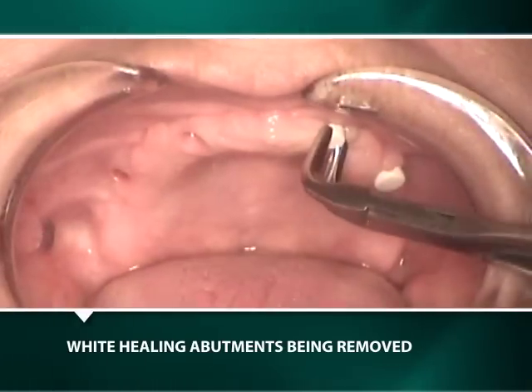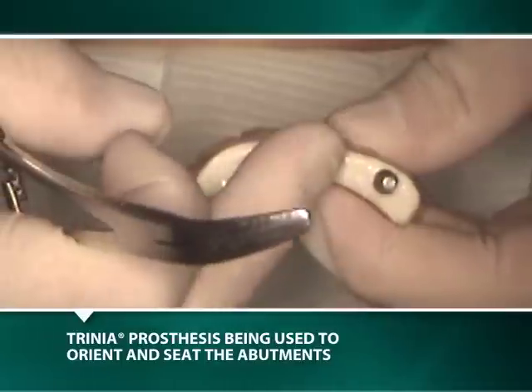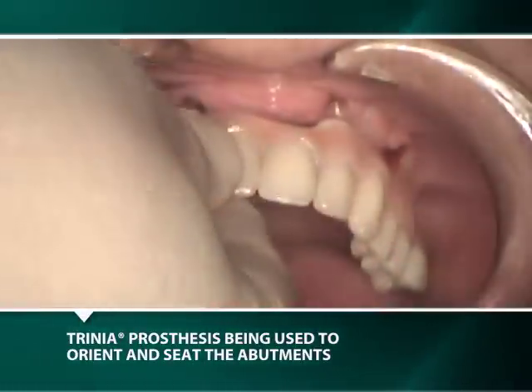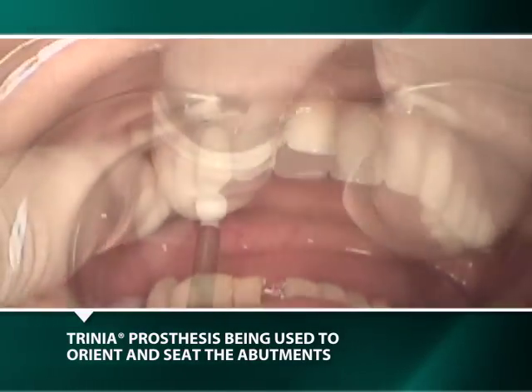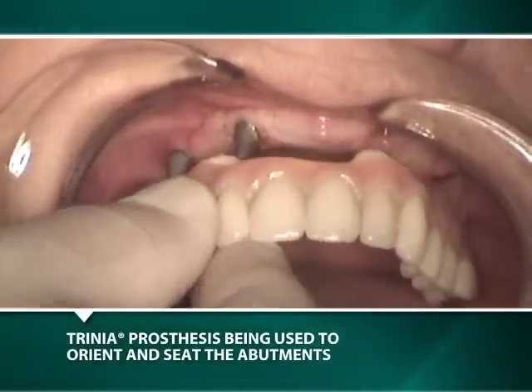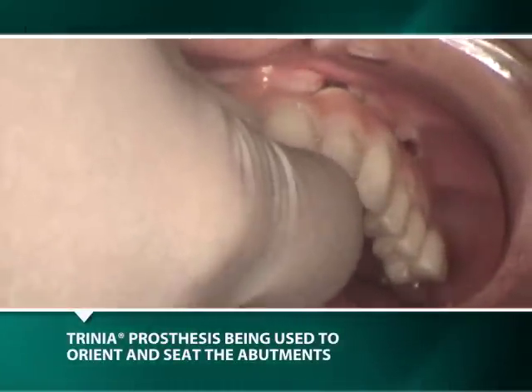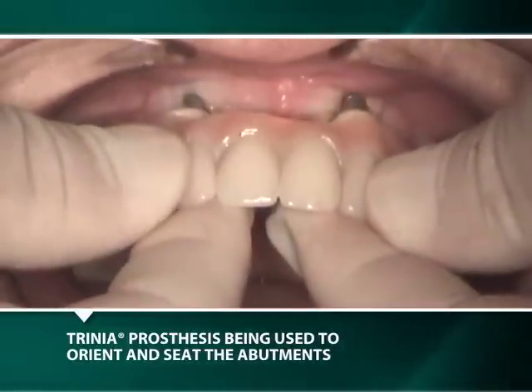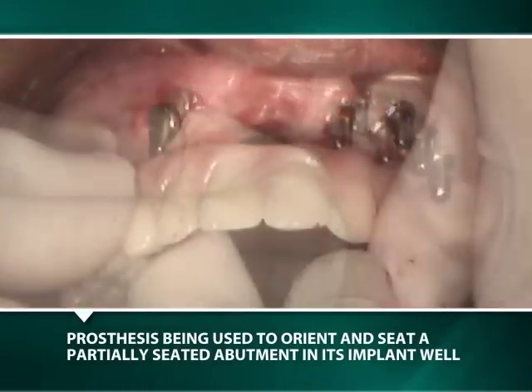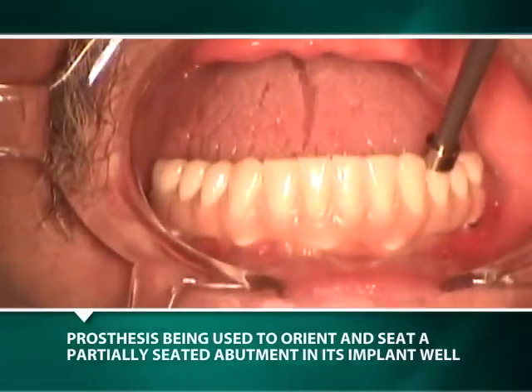After removal of the temporary abutments from the implant wells, at least initially, 2 milled abutments are incompletely inserted into the prosthesis and, if necessary, stabilized with an application of Vaseline prior to their being transported to the mouth and inserted into the well of their implant. Once the abutments are initially seated, the prosthesis is removed for the definitive seating by tapping directly onto the titanium abutment. This seating process is continued until all the abutments have been definitively seated. Alternatively, an abutment may be loosely seated initially in the well of the implant prior to the prosthesis being used to orient and seat the abutments in the well of the implant.